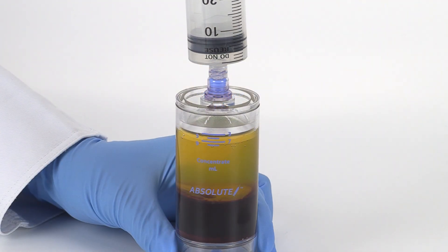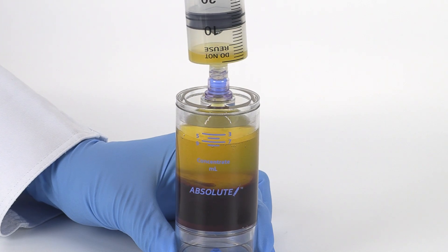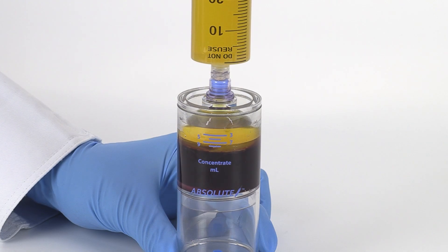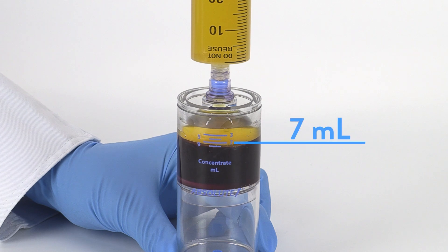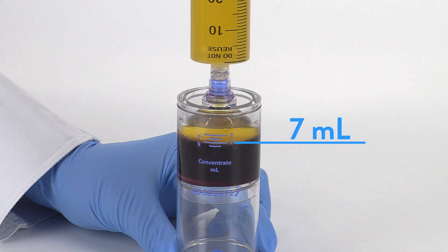Attach the sterile 60 milliliter syringe to the needleless port and aspirate the plasma. Aspirate until the red blood cell interface reaches 7 milliliters or the desired volume marker. This traps the plasma and platelet buffy coat layer in the aspirating cone.